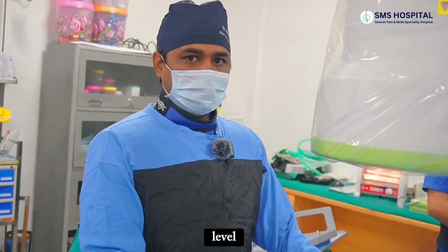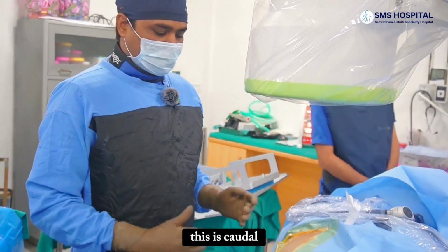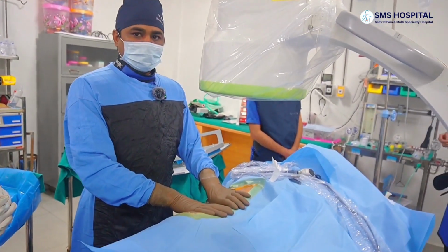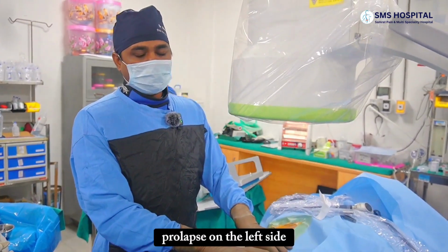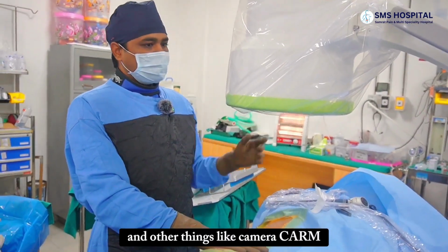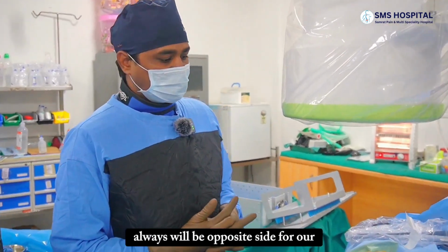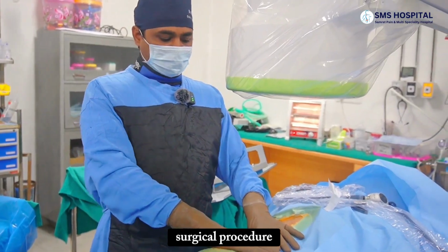The patient is in prone position, this is cranial, this is caudal, and we are standing on the left side because the patient has the disc prolapse on the left side. Other things like the camera, C-arm and our screen will always be on the opposite side for our convenience during the surgical procedure.